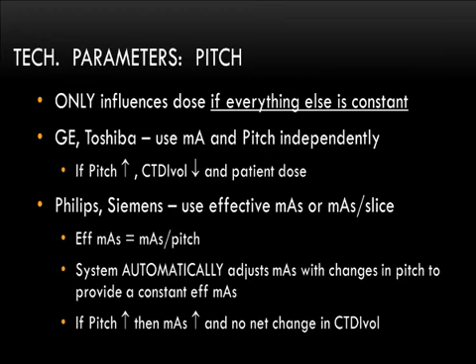I'm sorry, that's the state of our industry and our practice right now, so pitch is inconsistent. In some situations, it does change the dose. In other systems, it does not. But that will be reflected in the CTDI vol, either pre-scan or post-scan, so you can see that.